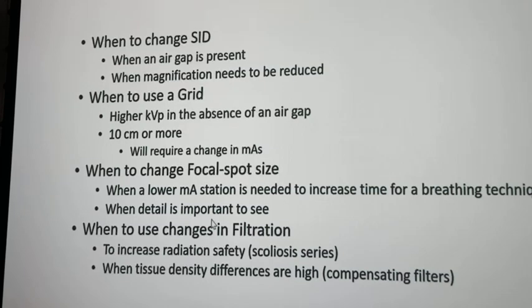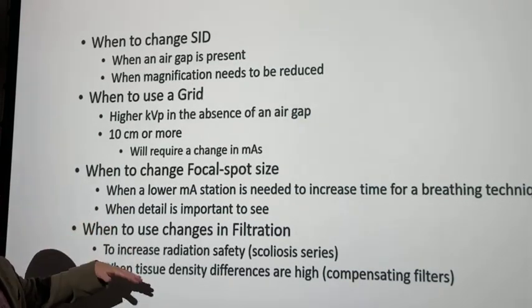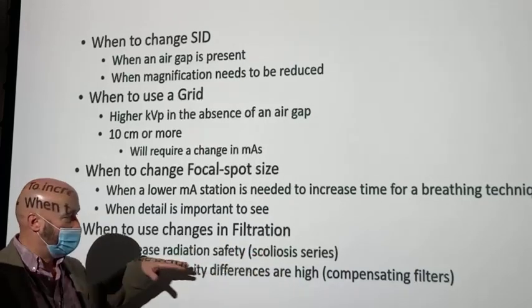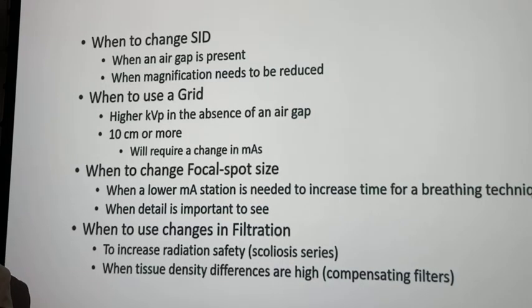Then filtration, realistically, you're not going to see a change in filtration unless you are working in a hospital where you routinely x-ray children, like scoliosis series or something like that. But in general diagnostic hospitals, you're never going to change your filtration. Now, your filtration will change because you've got tanning of the tube, but you aren't going to add filtration or remove filtration specific to the exam. Okay? Any questions?